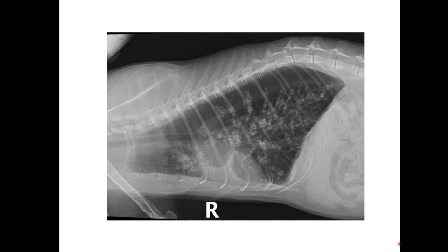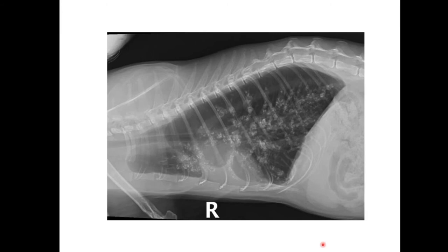There are no abnormalities within the musculoskeletal structures. The trachea looks within normal limits. The lung parenchyma looks to me a bit swollen — not super, super inflated, but it looks really, really radiolucent. We can see that scattered throughout the lung parenchyma there are these sorts of mineralization structures like a sort of grapefruit — they follow the bronchial tree, like a tree-in-bud pattern that we can see in CT.